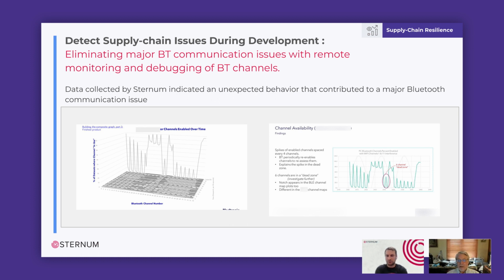That ability to compare is incredibly useful because we can compare between different pieces of equipment. But what it also allows us to do is to compare between performance before and after a firmware change. Like we just recently did a release where we contracted to have the Bluetooth stack modified to improve performance, and we fielded that now. And I'm looking forward to seeing the data from that, to compare to how things performed before that change. So this is a way of getting concrete feedback from the field as to what kind of impact your changes are making.